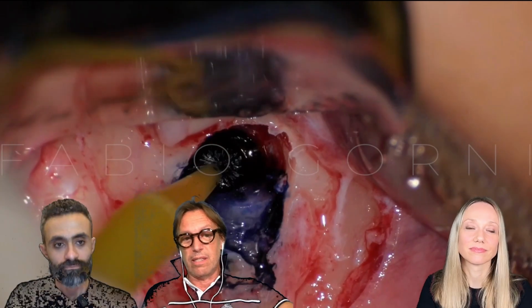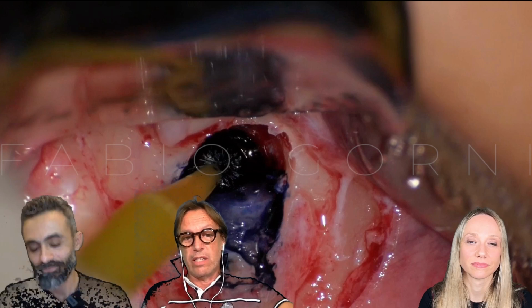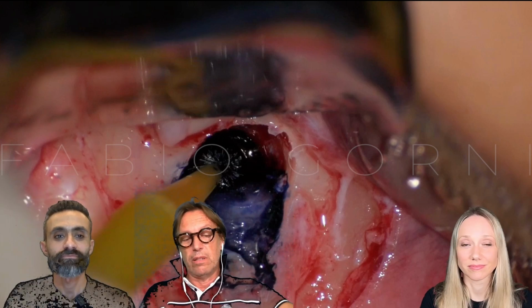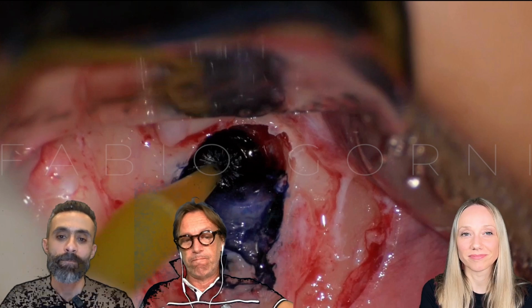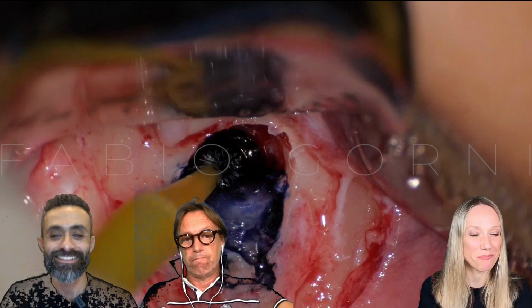Otherwise, in some actions, the head of the angulated handpiece will block the vision completely. So that's the reason. It's simple. Simple and very, very rational as an approach.